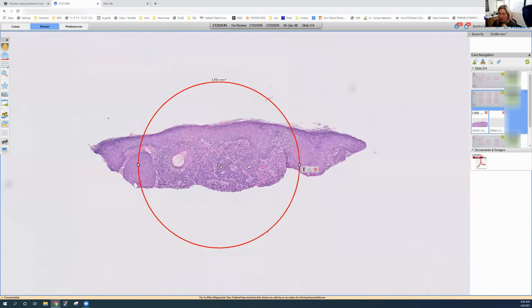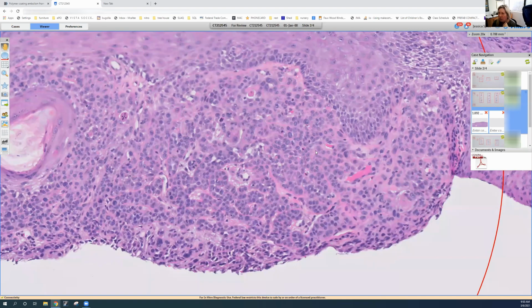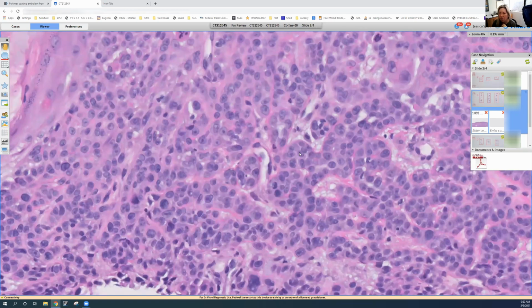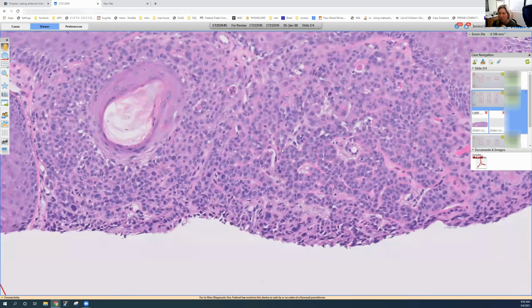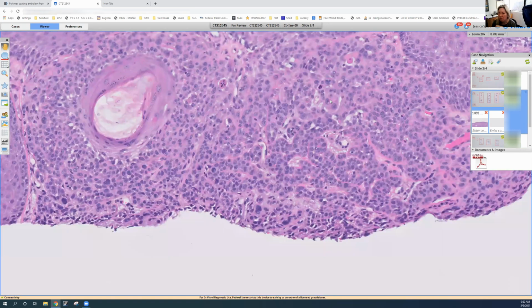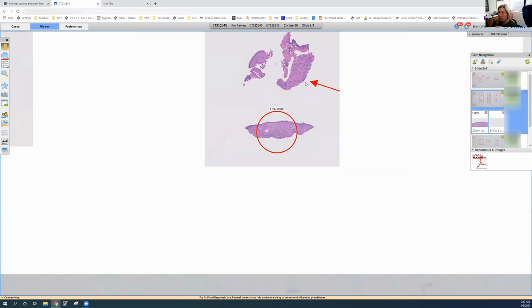And then in this very last piece, here we have what looks a little more like ordinary squamous cell carcinoma. The cells are pleomorphic, but not as bizarre as those in the last piece. And you can see some of these large cells, but it looks more like a conventional squamous cell carcinoma, making nests and cords of cells.